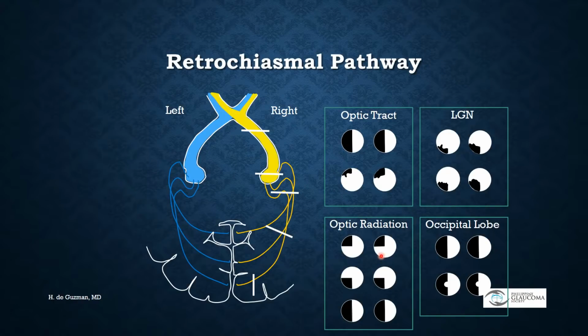This is the reason why we look at visual fields by laying the right visual field on the right and the left visual field on the left. It helps us detect more easily if there are defects respecting the vertical midline and that are hemianopic or bitemporal.